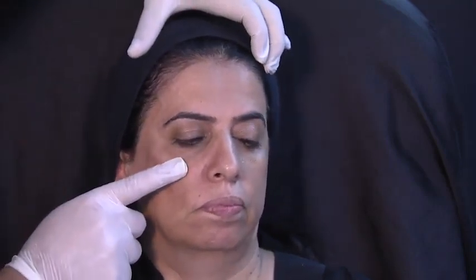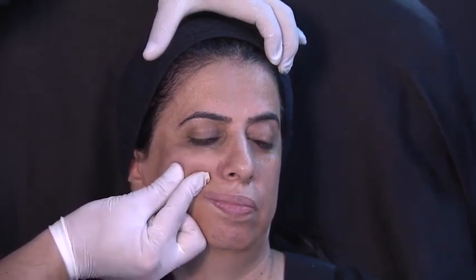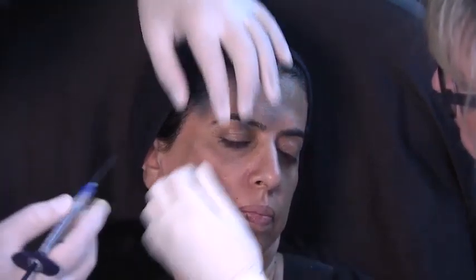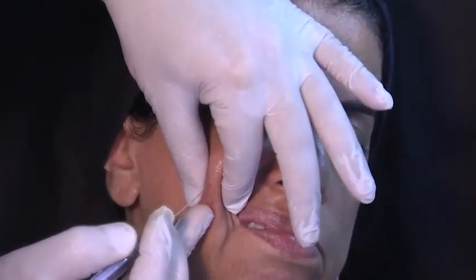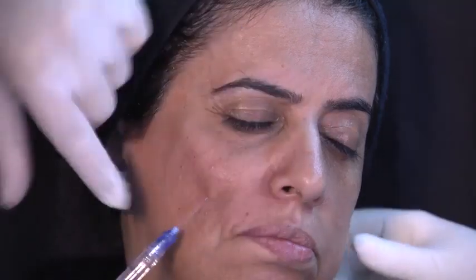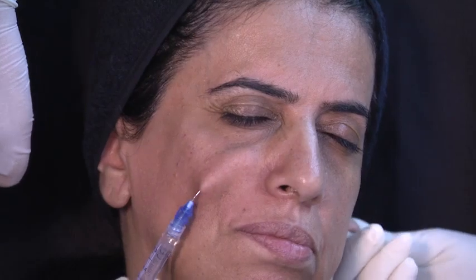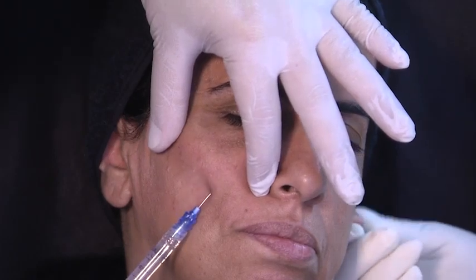And based on the tips I presented to you, helping you to position the products, one of the letters is I. So the second letter is I. Depending on the injection depth, we need to take a decision on which product. If I am injecting more superficially, I don't want volume because I don't want her to be like this at the end. I am going to use Refine because it's a product that is more suitable for a superficial injection or superficial fat pad.